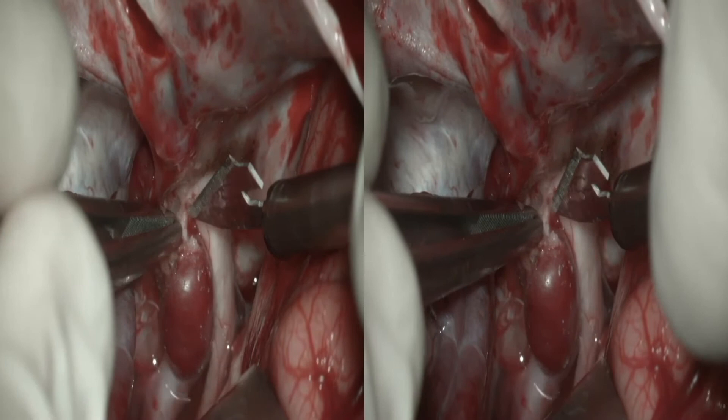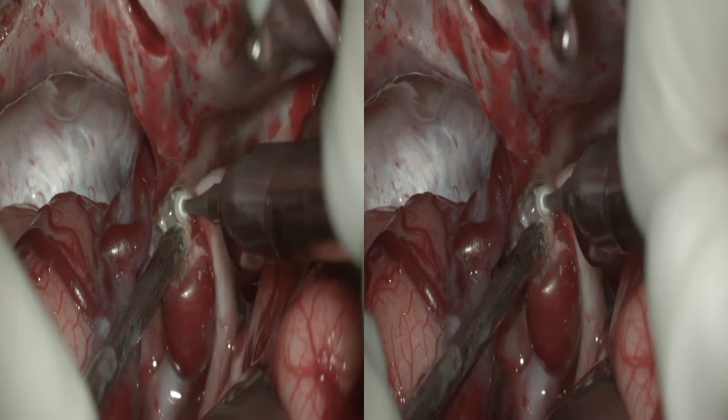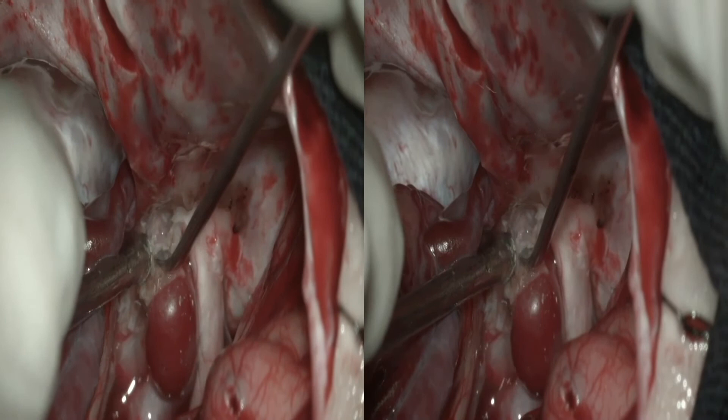The cancellous core of the anterior clinoid process is drilled away and its cortical margins are thinned. This cavitating technique methodically reduces the anterior clinoid and detaches it medially from the roof and lateral wall of the optic canal. With a micro dissector, the tip of the clinoid is then dissected in order to remove it.